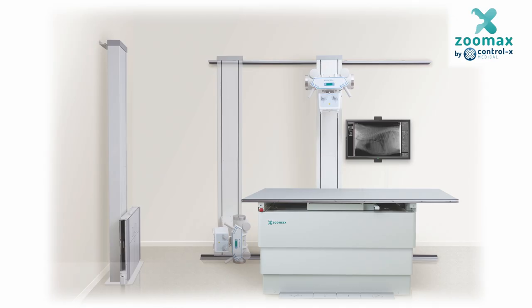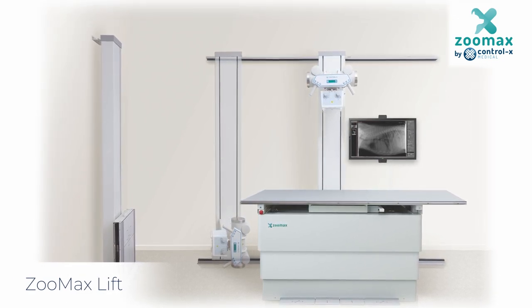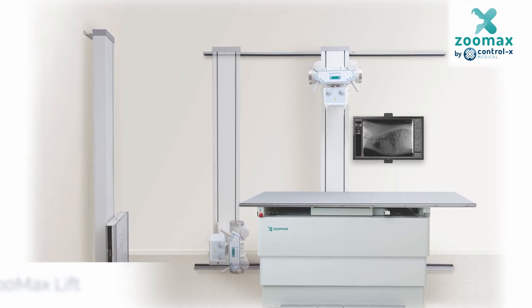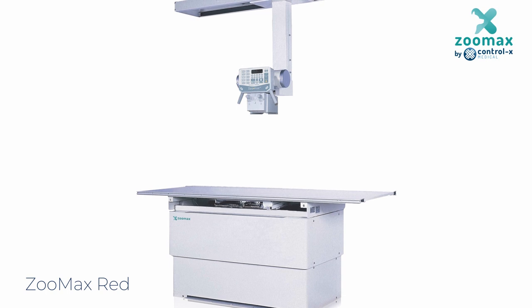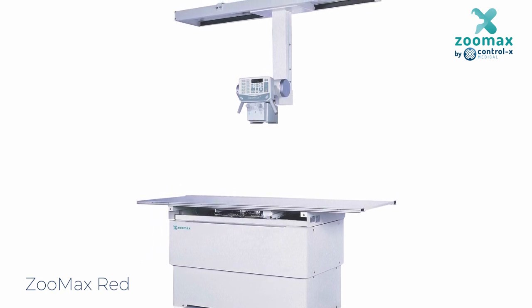Finally, while not on display today, our small animal range also includes the ZooMax Lift with full medical quality components for the largest veterinary centers, and the ZooMax Red which is fitted with an adjustable length ceiling tube stand for full access and positioning flexibility.